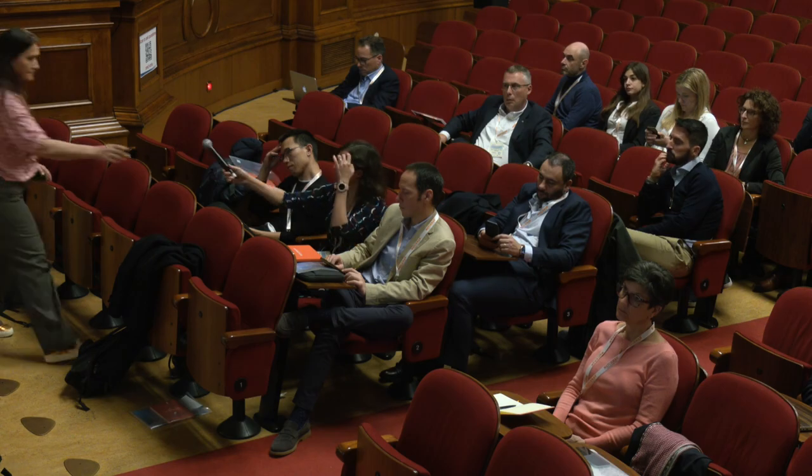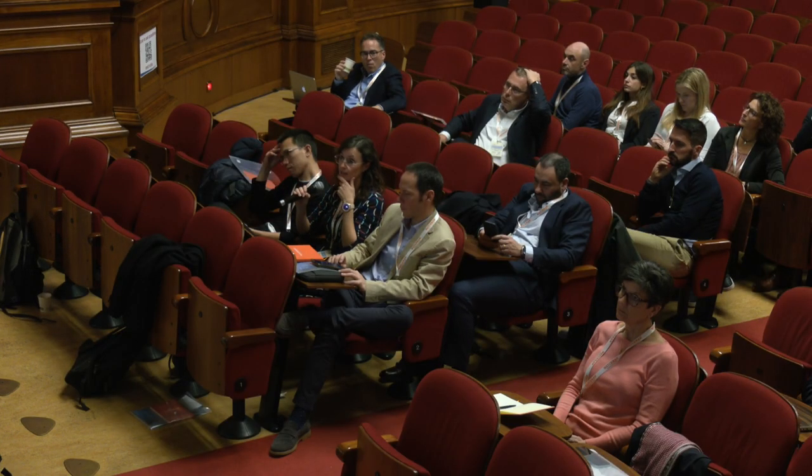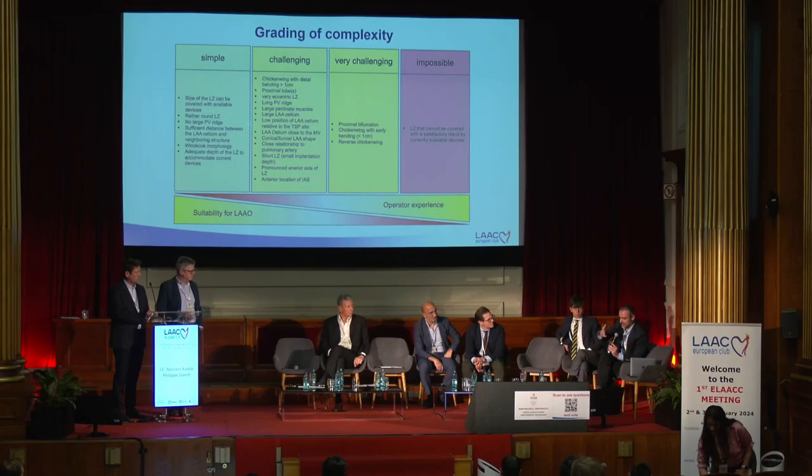I agree about that point, and the reason why we have this distal LAA is actually just to include the reverse chicken wing, because there we have a situation where we land a device in the distal part of the LAA and not exactly what is traditionally considered the landing zone. So at the end, it's because you think that your landing zone is there, so this is included in the landing zone. You could argue that. Yeah, so I actually completely agree.